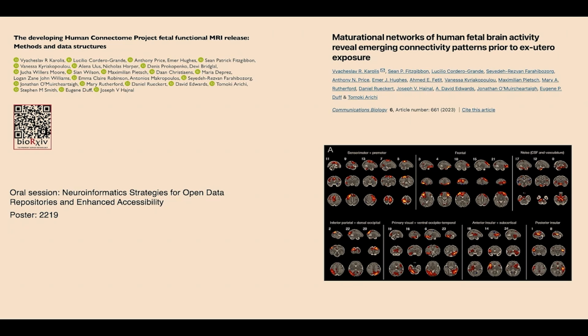Naturally, the data is acquired in order to study functional connectivity development in utero, which in itself is also an analytical challenge. And in the paper on the right, we proposed an alternative to group ICA methods, which we think may be more suitable for the data when we observe such huge maturational changes over a short span of time.